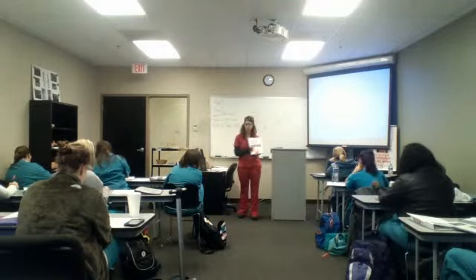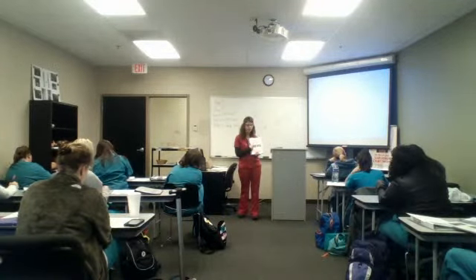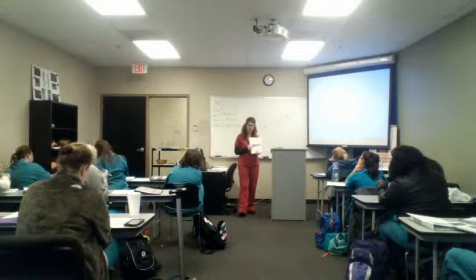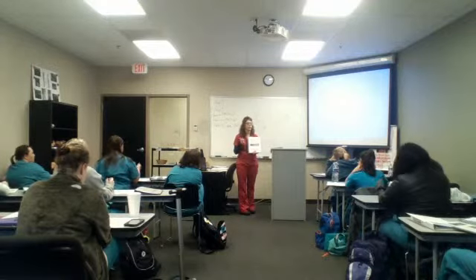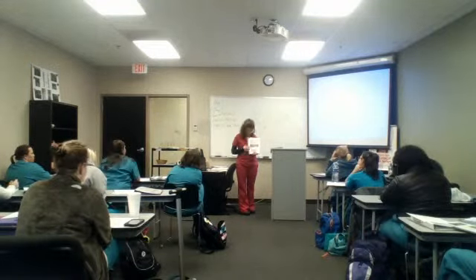And there it is. It's all by itself, because it doesn't have an artery with it. But where does it enter the deep system? Common femoral vein, and it's the what vein in the body? The longest vein in the body.